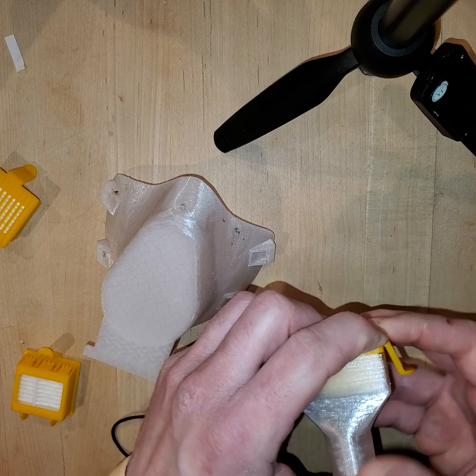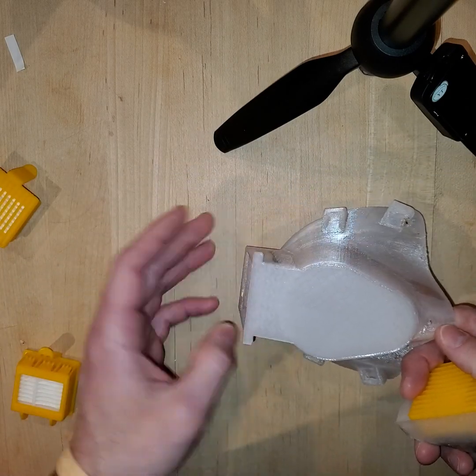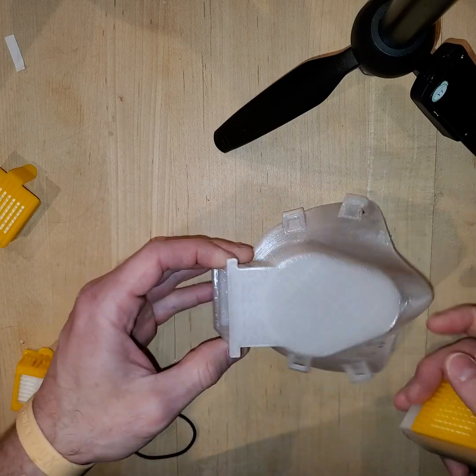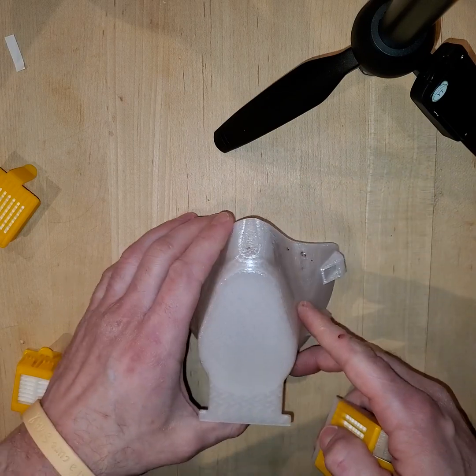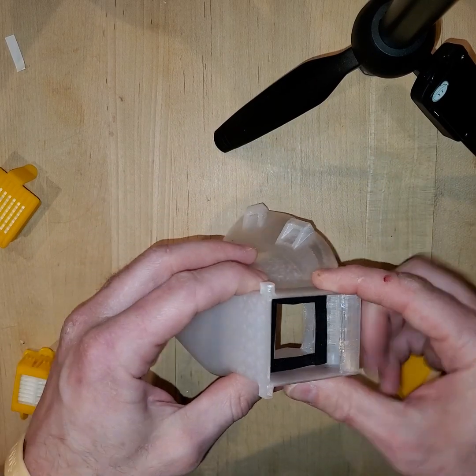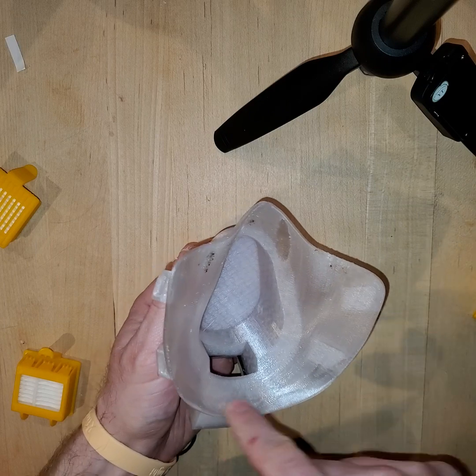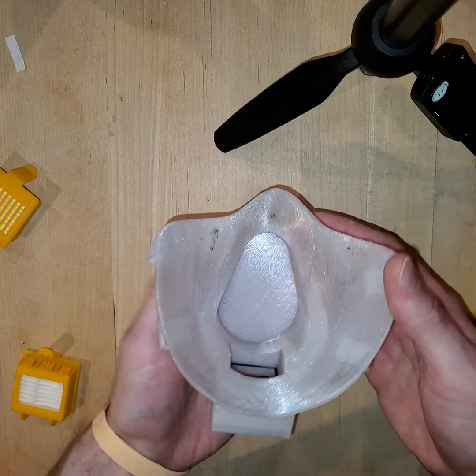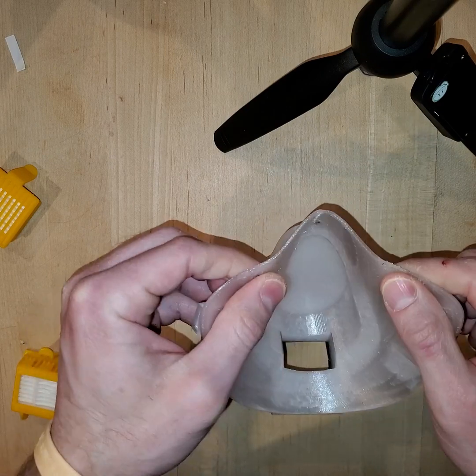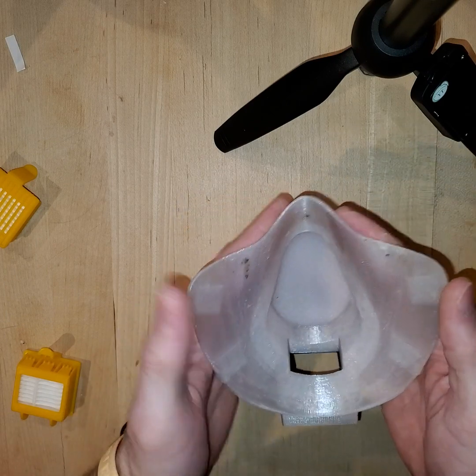Got a couple other things going on as well, a couple other designs, a couple options. This right here will probably change. Actually, in fact, I've already changed it a little bit. I brought this a little bit closer to the one that you have access to. And then there's a size smaller as well. You cannot just scale this print because then the port will change. So I have a large and a medium. By the time you add foam tape to the inside to make it seal, and also if you use FDM printing, you can heat anneal it, warm it up and adapt it to the face. But once you use foam tape, it should create the seal that you want.